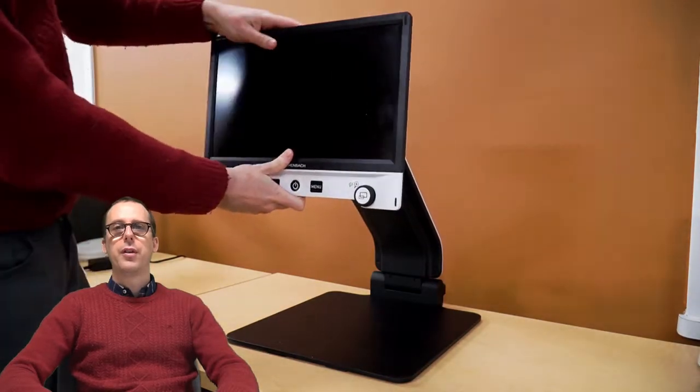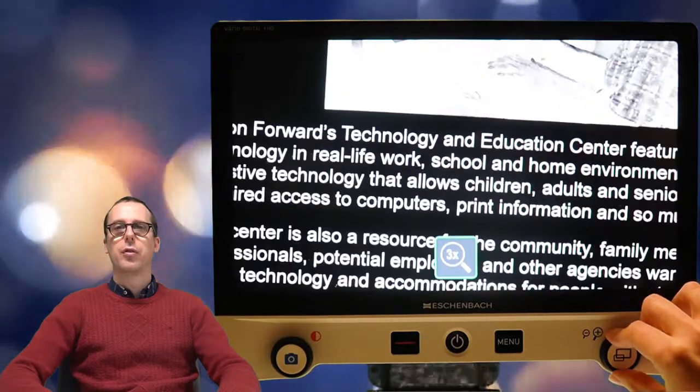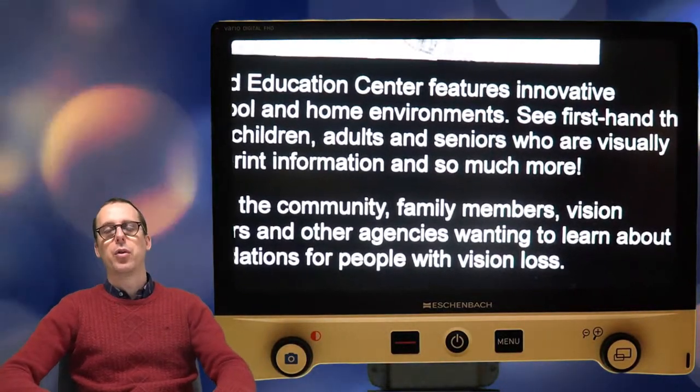And once you've unfolded it, then obviously you can start to use it to magnify whatever you want. So it's going to be good for reading and for doing handiwork and things like that underneath, and writing and all of that type of good stuff.